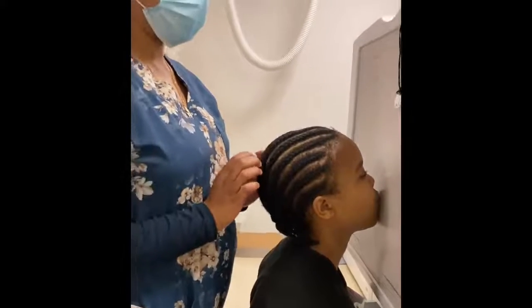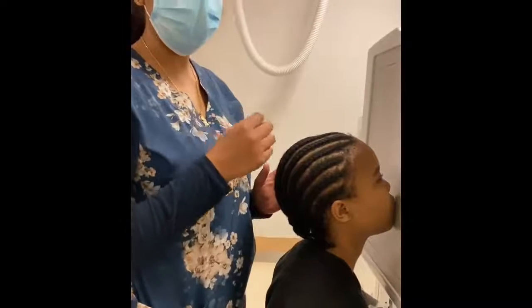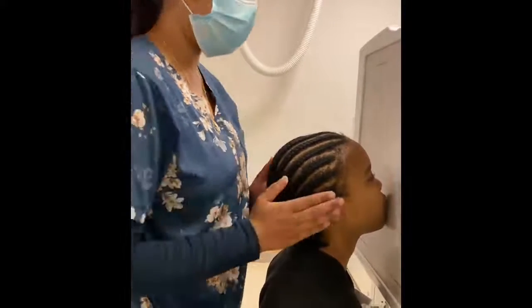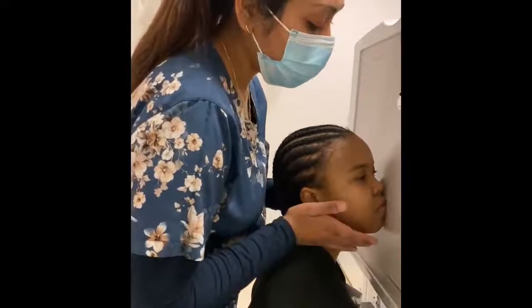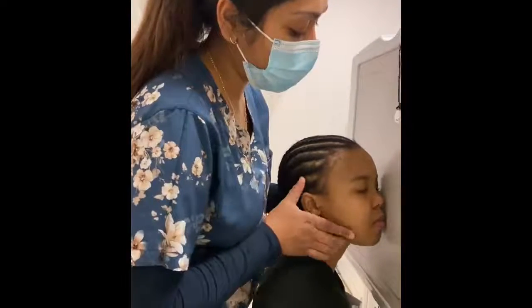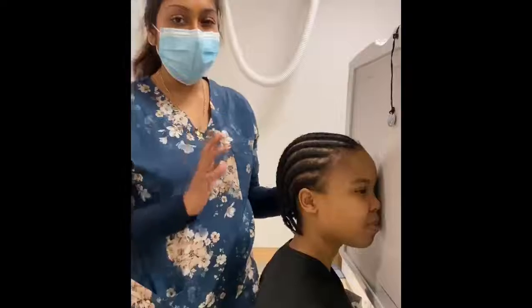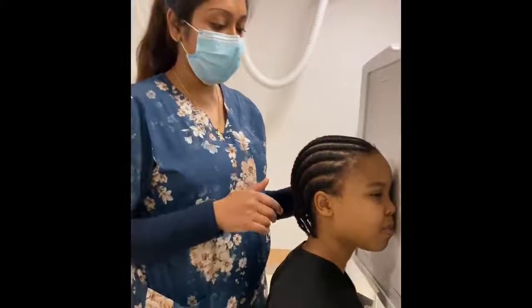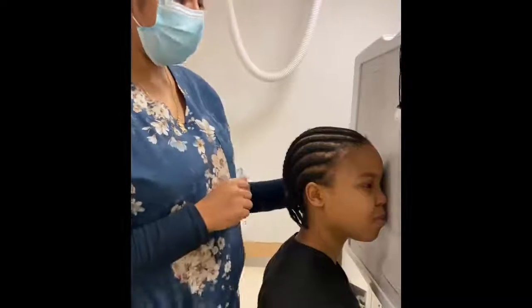From this position, we need to adjust the patient's head so that the patient's chin, cheek and nose are against the image receptor. So I'm going to turn my patient's head and adjust it so that the chin, cheek and nose are against the image receptor. It is a bit uncomfortable for the patient, so remember to be gentle and careful of how you're positioning.